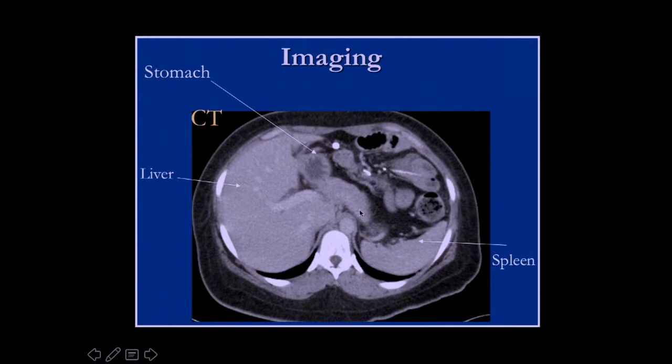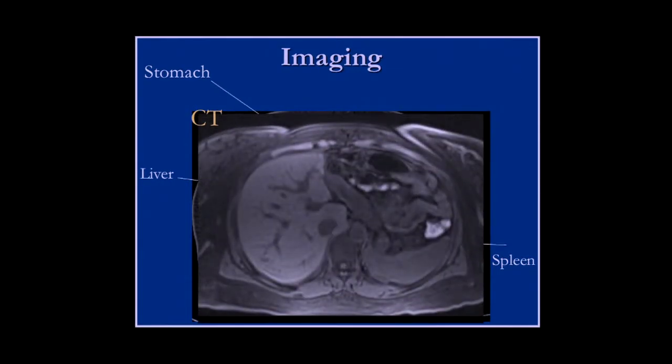We have pancreas, and here we have the portal vein, because the patient's had some X-ray dye introduced into it. Again, very crisp. Now what about an MRI at the same slice? Very different. The tissues have different colors, or shades of gray perhaps.